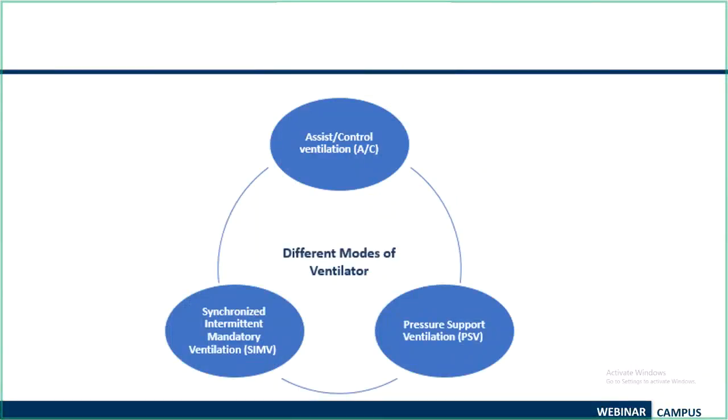Coming to the modes of ventilation, there are different modes of ventilators. We have assist control mode, pressure support mode or a spontaneous mode, and in between we have something called SIMV mode. We were all thinking about control mode also, and all the topics we were discussing were control mode as well. But dear friends, please understand, there is no control mode in any of the present ICU ventilators. The control mode is there in anesthesia ventilators, not in any ICU ventilators.